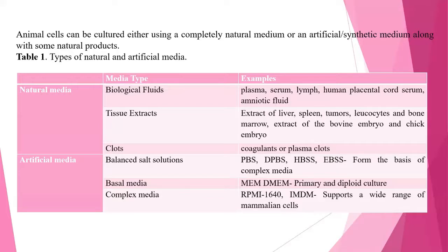culturing the cells. Okay, so the only thing they saw was that all these biological fluids of course enhanced the growth of the cells, but there were some ups and downs in the growth, either the characteristics were different or they might not survive for a longer time in such media.